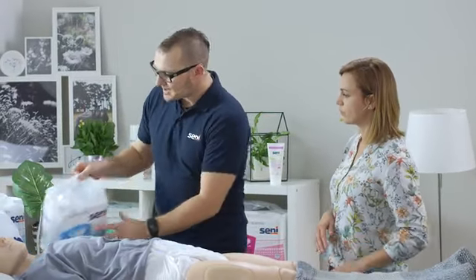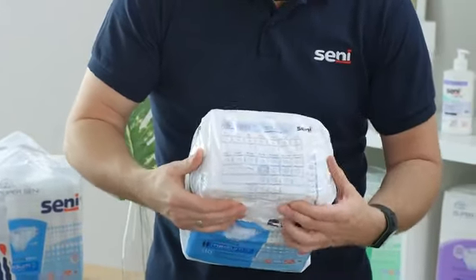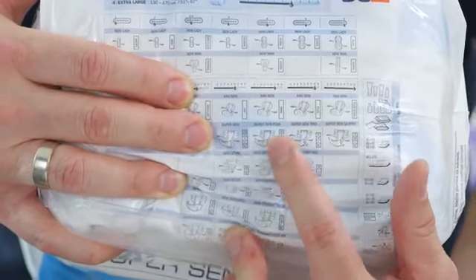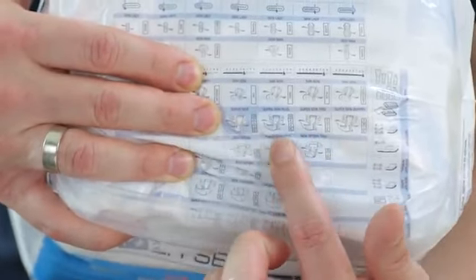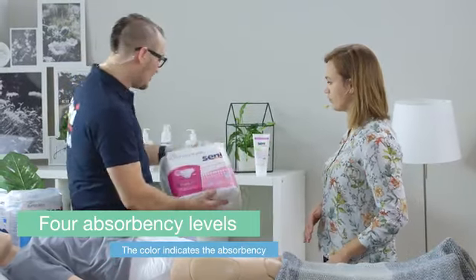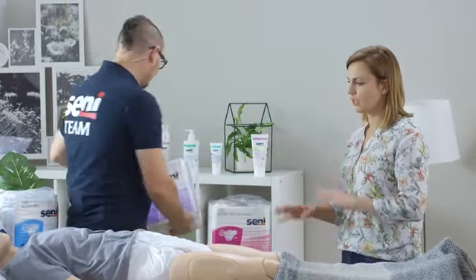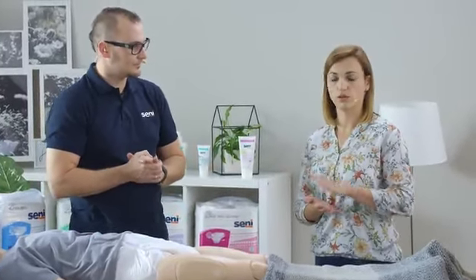In case of adult diapers, how many levels do we have? In case of adult diapers, we have as many as 4 absorbency levels. If we look at the packaging, each package has the levels shown there in a table. Vertical lines mean different levels of absorbency, and here we have our adult diaper group, which we are talking about at the moment, meaning Super Seni, Super Seni Plus, Super Seni Trio, and Super Seni Quattro, where each level of absorbency is marked with a different color. And here, for example, the highest absorbency level, Quattro, is shown in purple. Depending on what absorbency we need, we can choose from these 4: Super Seni, Super Seni Plus, Super Seni Trio, and Super Seni Quattro.